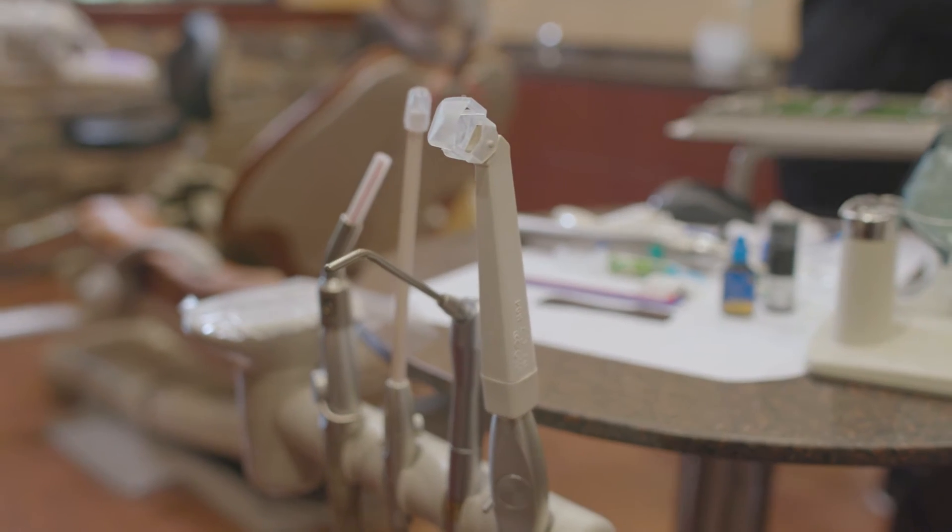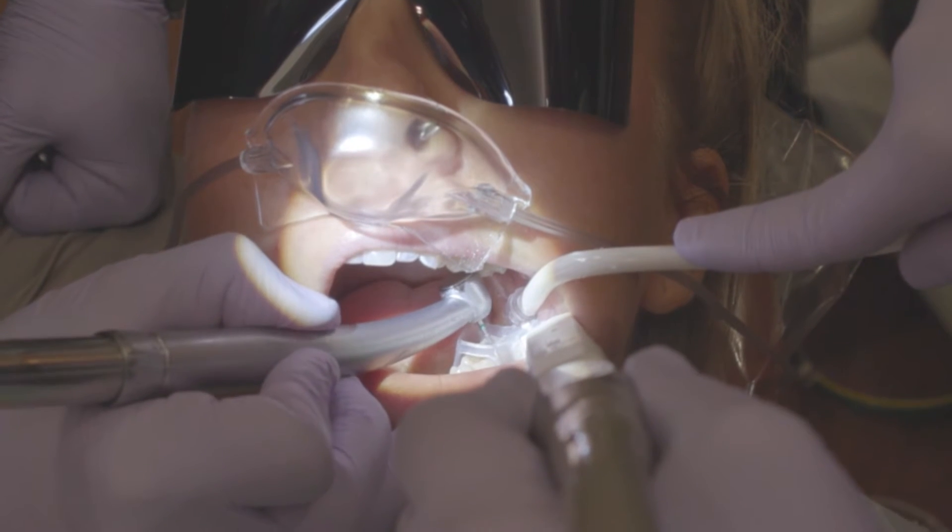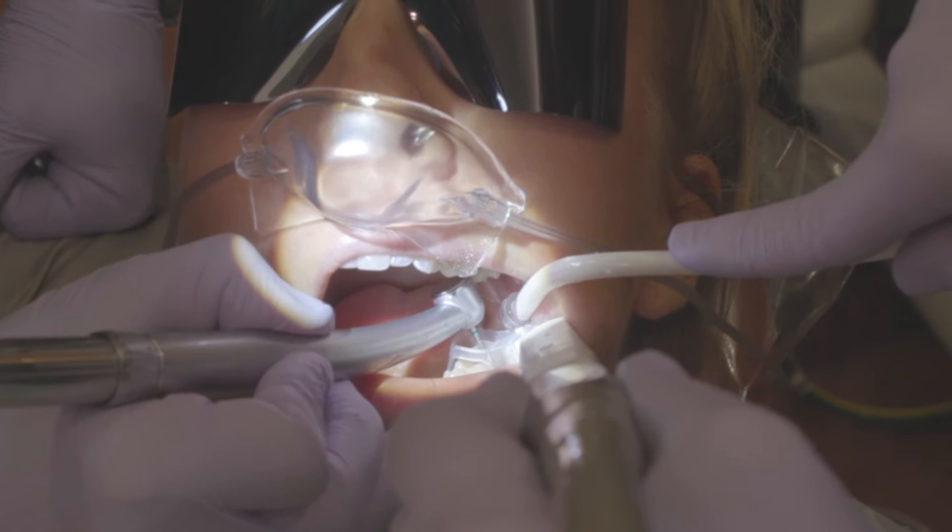Third, we use a specialized suction tip which goes directly around the tooth and hugs the tooth, making almost intimate contact with the gum tissue, not allowing any of the overspray, refuse, or vapors to enter into your mouth or into the environment.